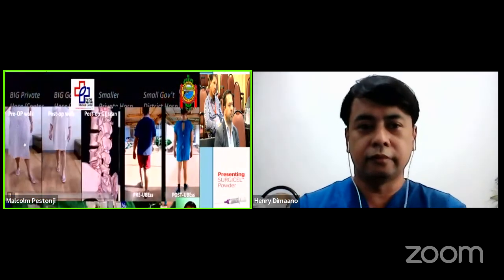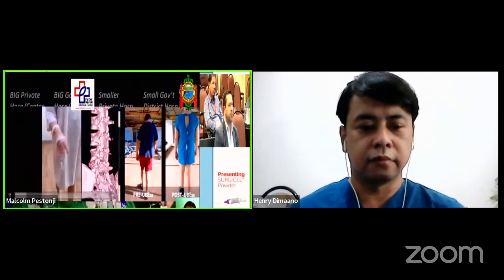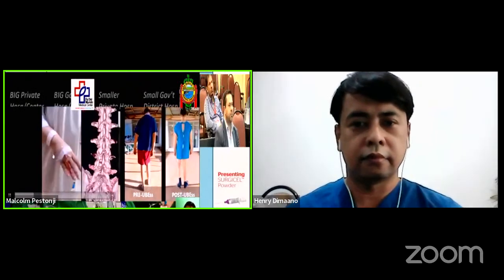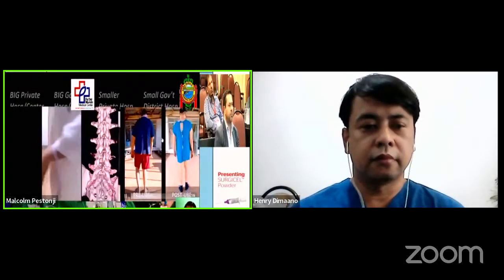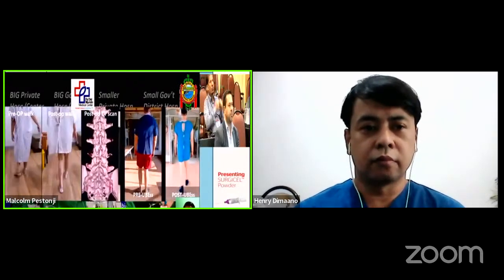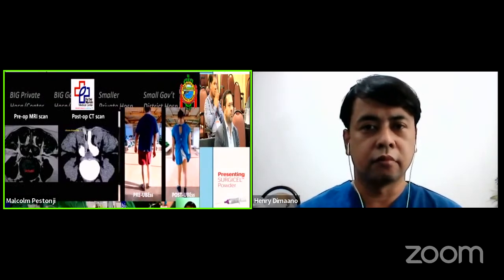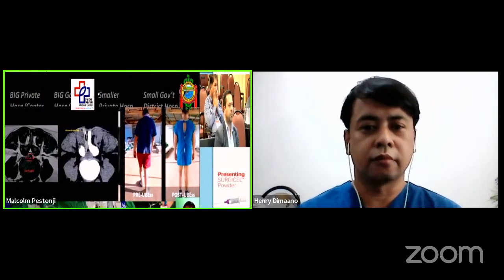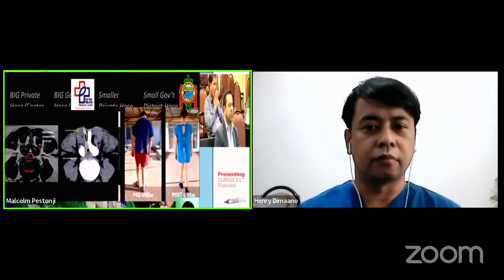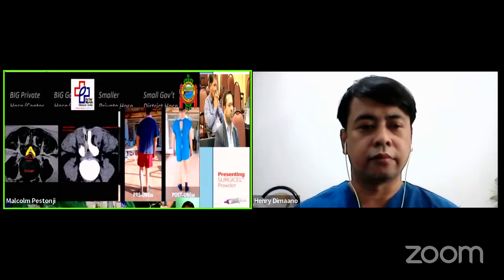This is the kind of UBE surgery that I've done in my small private hospital. CT scan showing the opening. Patient is walking better after surgery. This is the surgery that we do in the small government hospital. So we basically get the same results. The major difference between my small private hospital and my small government hospital is that the small private hospital has an endoscopic tower. The government hospital doesn't have an endoscopic tower, so I'm reliant on my laptop. But other than that, the surgery is the same.